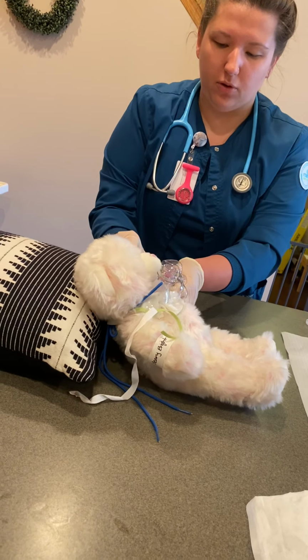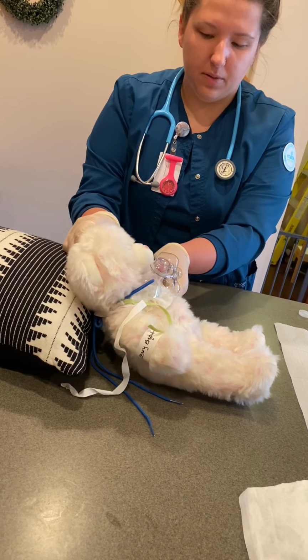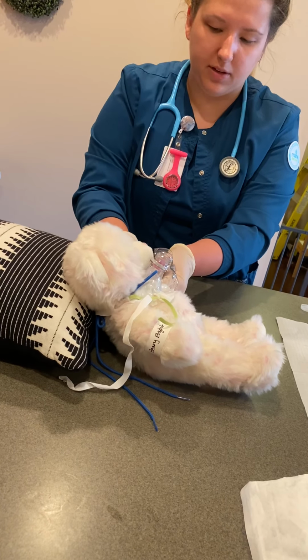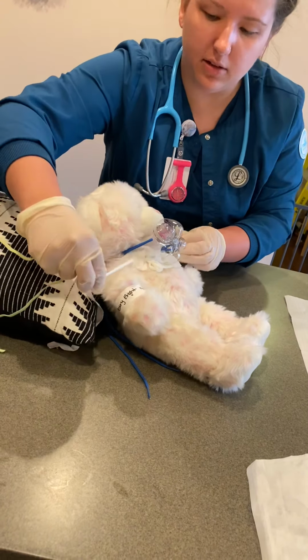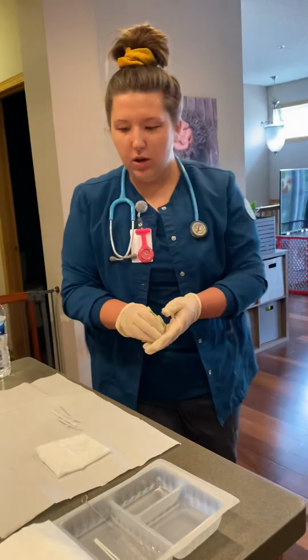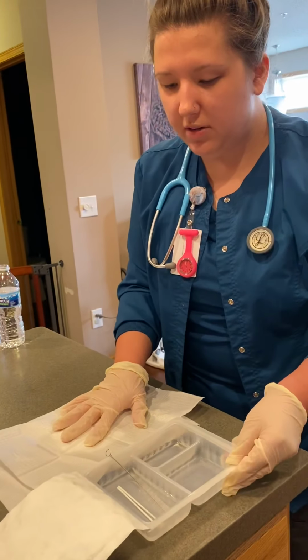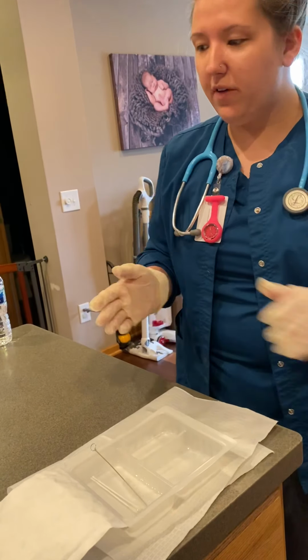going to now remove the old ones, still wanting to ensure that I keep everything tight so that the trach does not become dislodged. So I'm going to remove the old ties, ensuring that that is placed. Okay, so now I'm going to discard my supplies. I'm going to keep them decent for additional use purposes, but I would discard of everything.